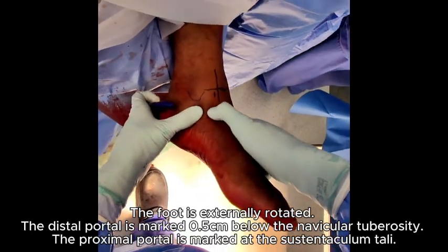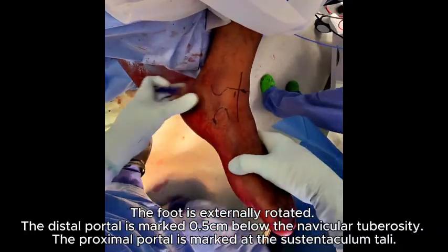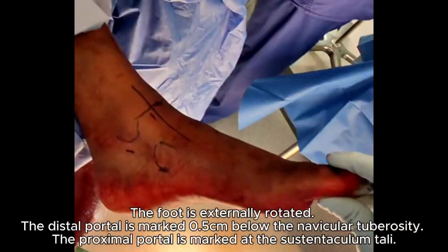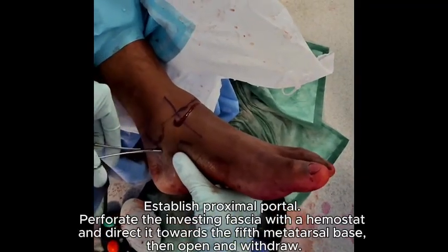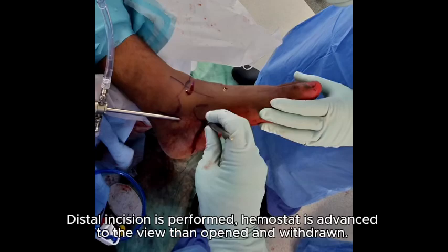Position supine. Foot is in externally rotated position. The distal portal is marked 0.5 cm below the navicular tuberosity. The proximal portal is marked at the sustentaculum tali. Establish proximal portal. Perforate the investing fascia with the hemostat and direct it towards the fifth metatarsal base. Open and withdraw. Arthroscope is introduced in the same trajectory.